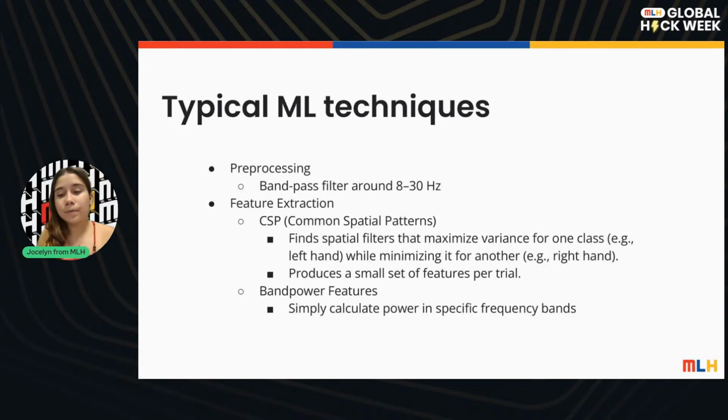Okay, so there are some typical machine learning techniques that are used. It's more of a process that you need to follow. There are three important steps. In this slide, I only have two of the steps. I will show you the third one once we get there. For the first one, there's pre-processing, which is kind of the thing that we were doing already.